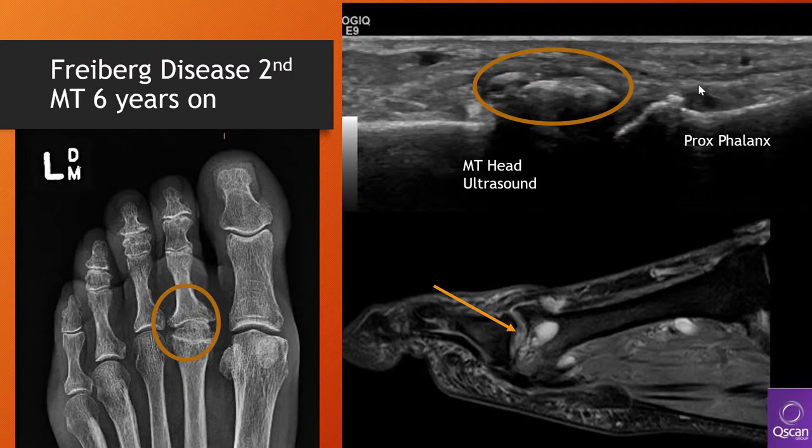So due to misdiagnosis, we can see that this patient has now total loss of her joint space. So necrotic tissue was replaced by osteophytes. And the MR shows the concave epiphysis along with subchondral bony cysts. And on ultrasound, we can see that osteophyte. So it's likely that restorative surgery employed a little earlier could have prevented her progressing to this grade 5 disease.